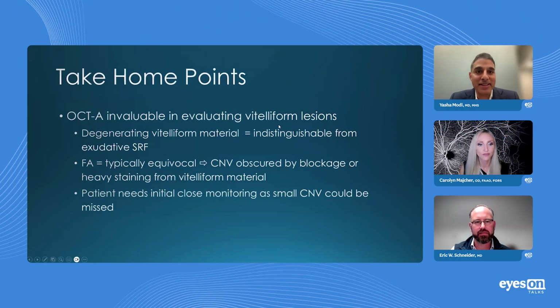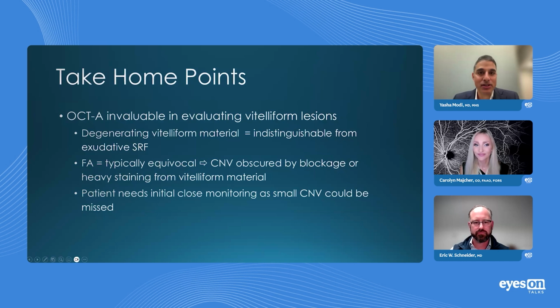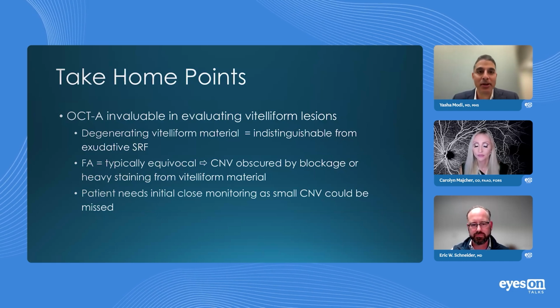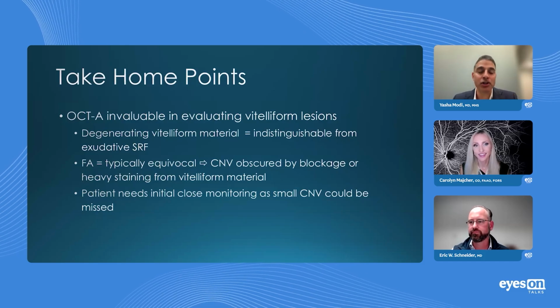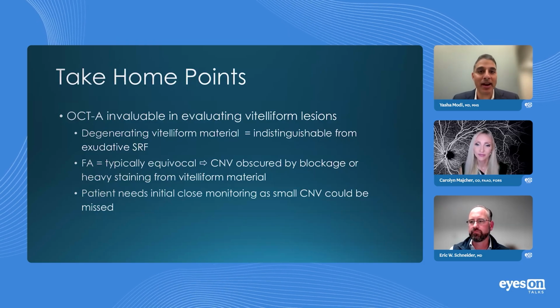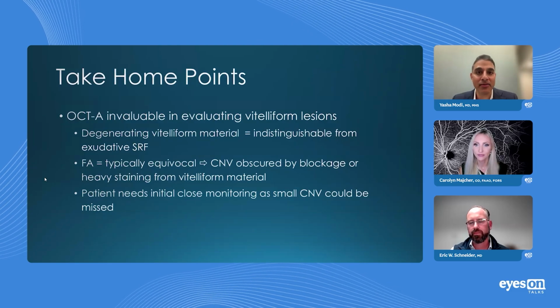Really tough case. I think these are sometimes some of the hardest cases to really identify what is the appropriate strategy. And sometimes, even like the way you started that case off, sometimes you just have to try, right? And then eventually your imaging technology will catch up, as it did in this case, to really highlight the fact that you had choroidal neovascularization in the right eye, but not in the left eye.